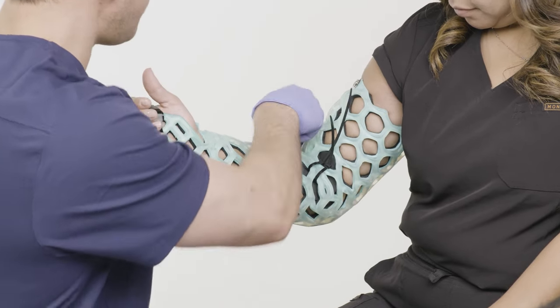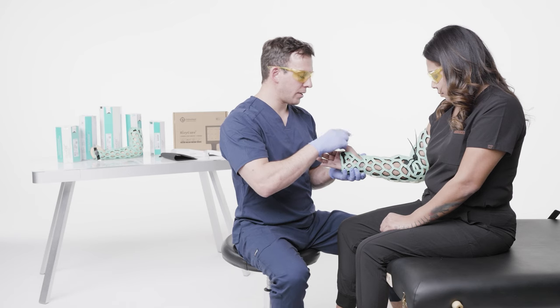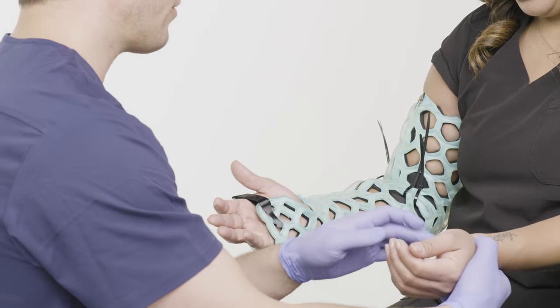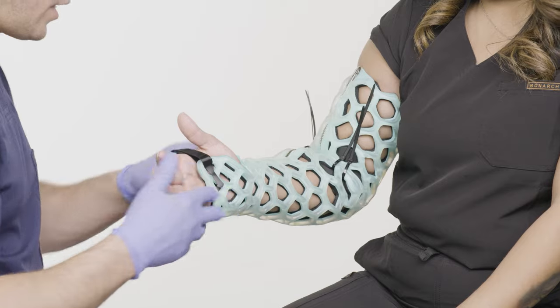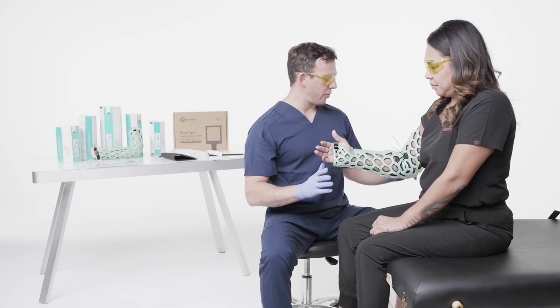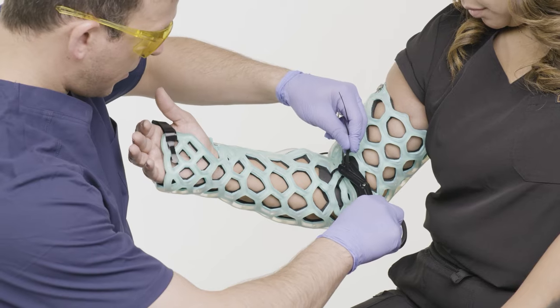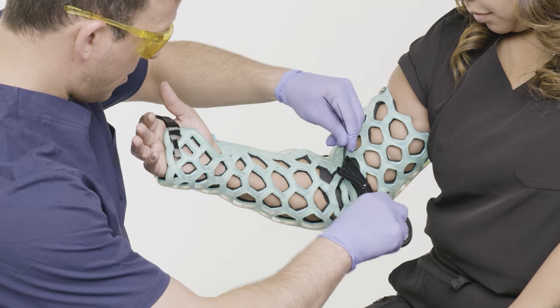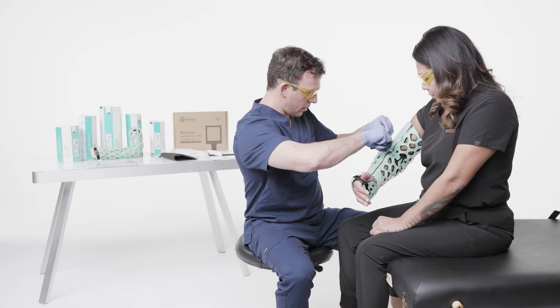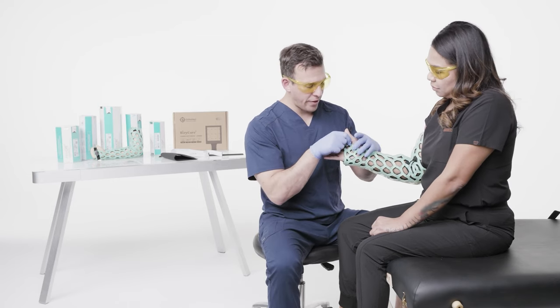You can always cut these — patients do not like the tails. Make sure that your patient can still feel all the sensation checks distally. They are neurovascularly intact distally. So before we finish, there are a few things we need to do: cut the zip tie tails right here so they're not hanging. Also worth noting — the blue light won't penetrate the velcro, so you may still have a sensitive area there that may need extra curing.